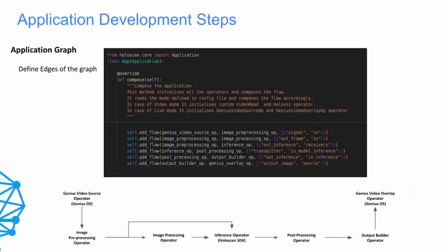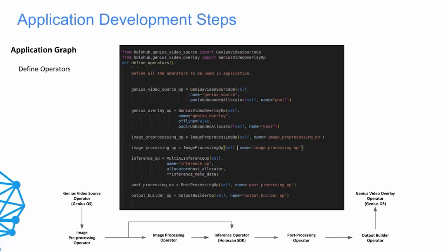For application defining, for simplicity, I'm not defining any fragments in this sample application, so I'll just show one fragment. This is how you use the add flow API to define which operators have which ports linked to each other. Signal and input ports, for example, over here are linked to Genius video source and image pre-processing operator. This graph is depicted over here at the bottom. This is how the operators are defined within the Holoscan application. You can define your custom operators and have them named operators with different memory allocations.